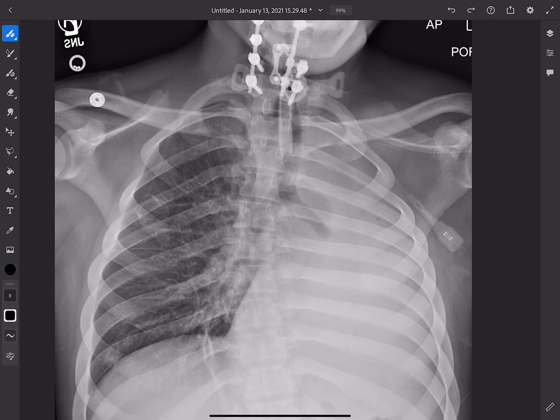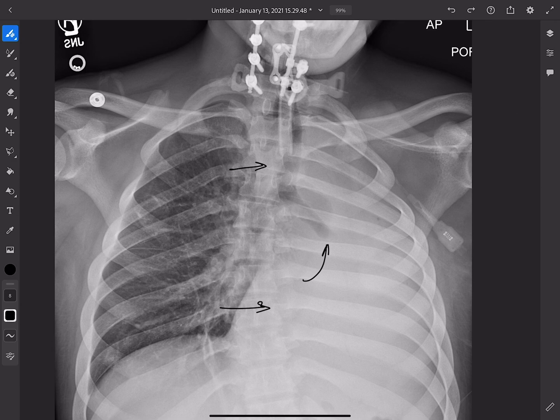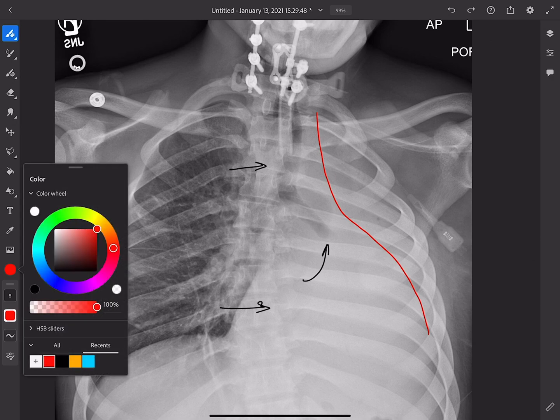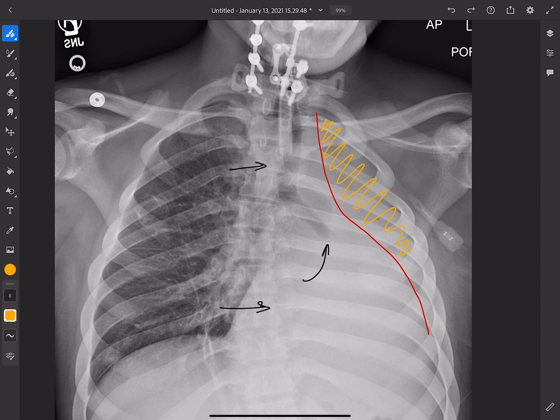In this first case, we have complete opacification of the left hemithorax and a bronchial cutoff sign, because this patient had a mucus plug causing collapse of their left lung. Because the mediastinum is shifted towards the side of the opacity, we can say with a pretty high degree of confidence that this is isolated collapse of the lung without a significant pleural effusion. The mediastinum has shifted to fill the space once occupied by the aerated left lung — this is a collapsed lung without a pneumothorax.